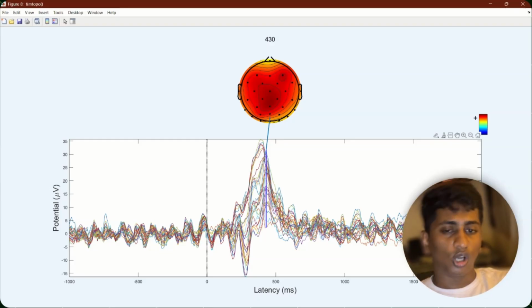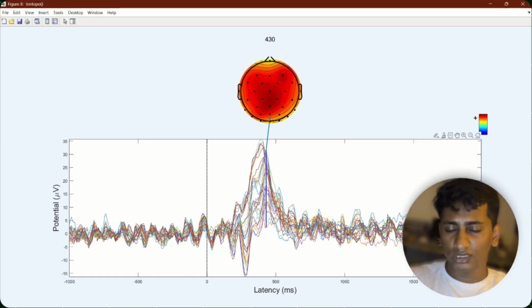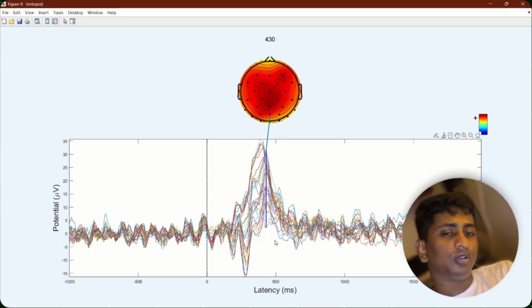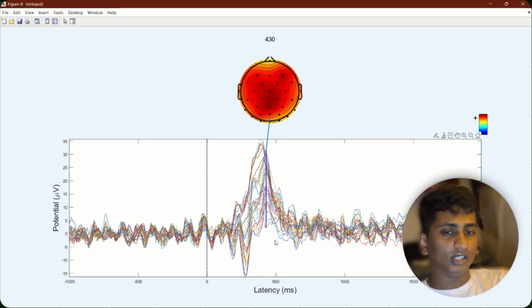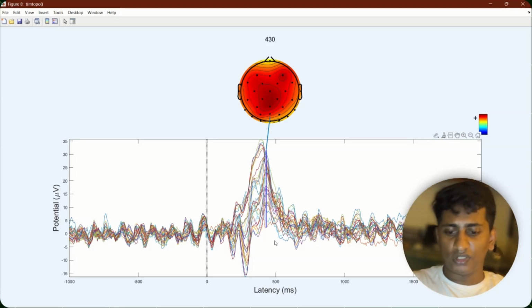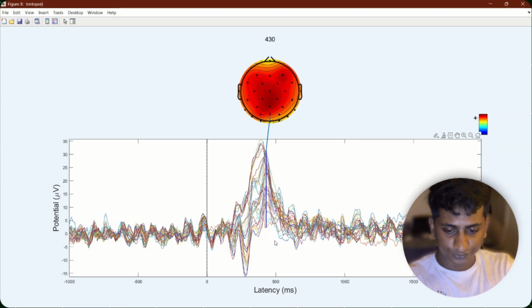Next, you can go for scalp maps, combining multiple channels. It automates handling a lot of artifacts, and there is no need to do this mathematically. All we did here was using mathematics, right? You need not do this mathematics; you can just give the training dataset and try it. It is easier for the system to train on images rather than being given billions of data points. This is how the frequency runs.